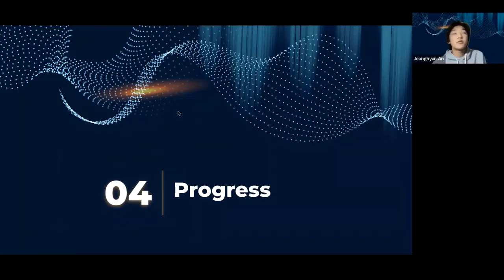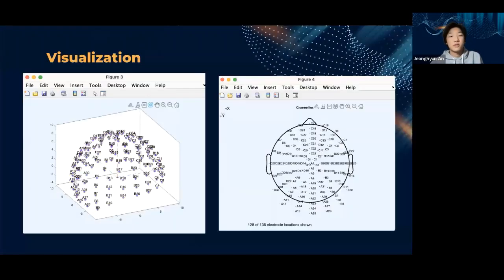All right, I'll be showing the visualization that EEG Lab has produced for us and showing you the progress we have made with pre-processing so far. Firstly, this is one of the data visualization tools we get from EEG Lab. It basically shows the location of the channels. As Rick explained, there are a lot of channels for EEG, and for our data set, we have 128 channels, and then 8 additional external channels.